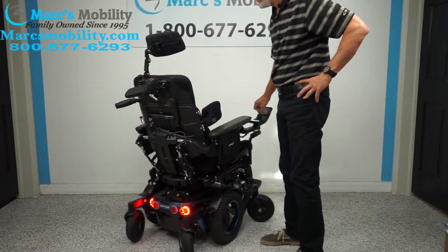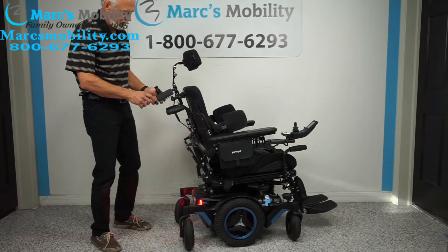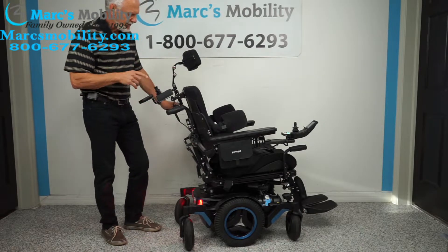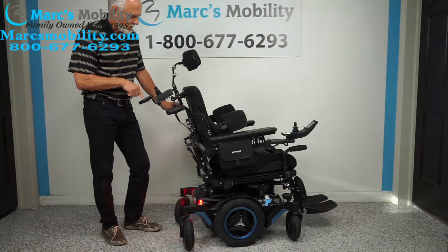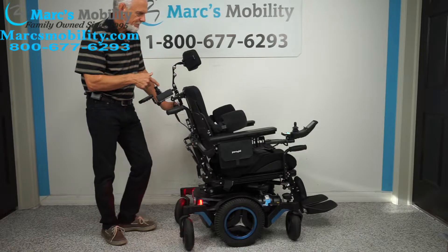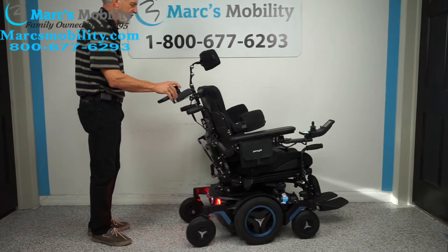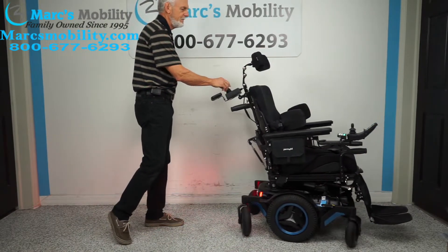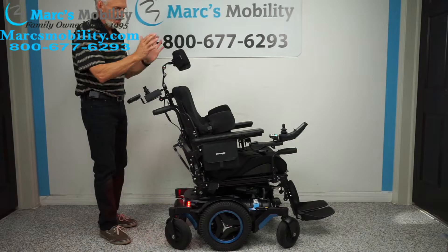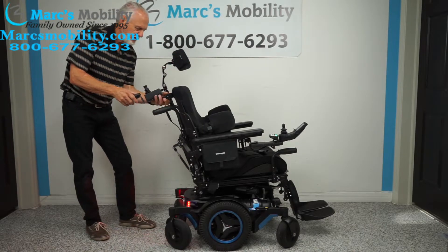This chair also has an attendant control back here. I can drive this chair from the back if I want to — I just hit the button with a picture of a person behind the chair to switch it over. When I do that, the front joystick becomes inactive, and from back here I can drive the chair and control the tilt and everything else with this little joystick.